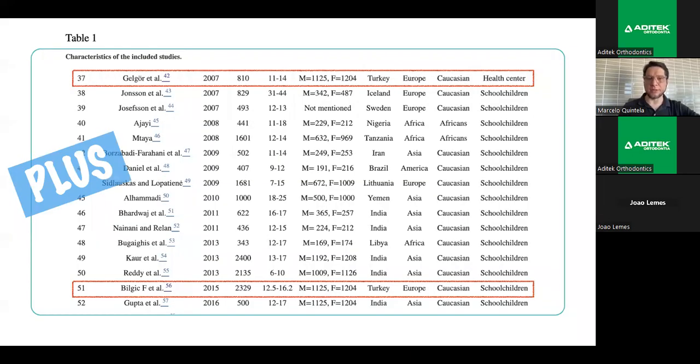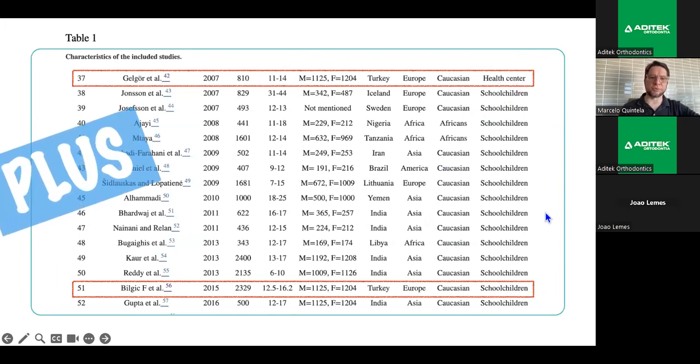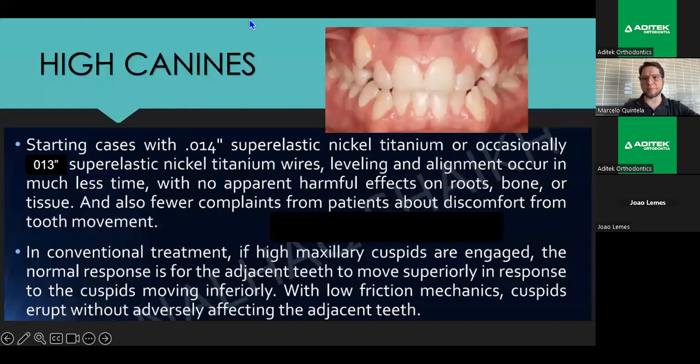Included in this systematic review are 2 Turkish studies with a lot of school children, or children from a health center, examining Caucasians. So plus is a very important prescription because you can resolve high canines, for example, without extraction of bicuspids. But how can I do that? Starting cases, it's our protocol.